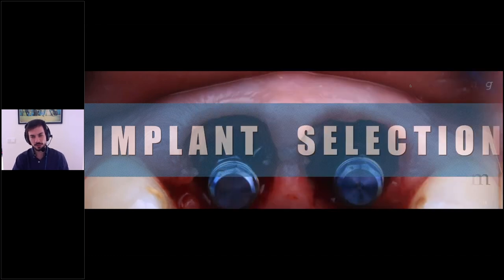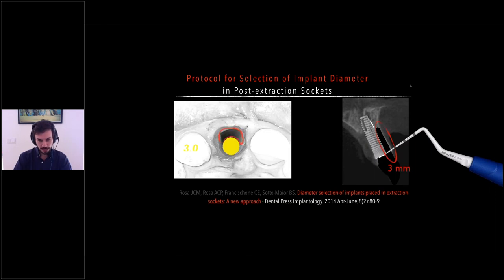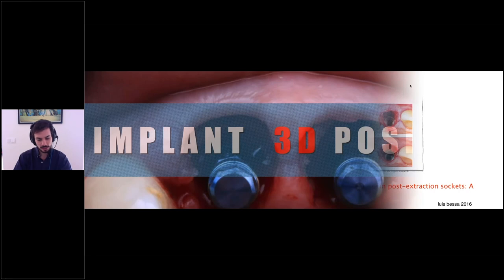So the implant selection, how we do the implant selection for each alveolus, I'll be doing using this article as a guide. This article is from José Carlos Martins da Rosa from Brazil. He developed this article to select the implant size for his technique, the immediate intra-alveolar technique. But I'm transferring it and using it in socket shield procedures, and it helps me a lot. So we select the implant by measuring the buccopalatal dimension of our gap. And if the gap is less than 7 millimeters, we use narrow implants.